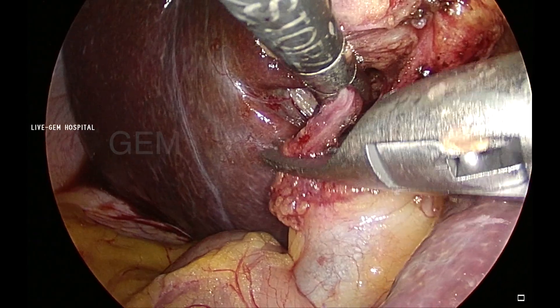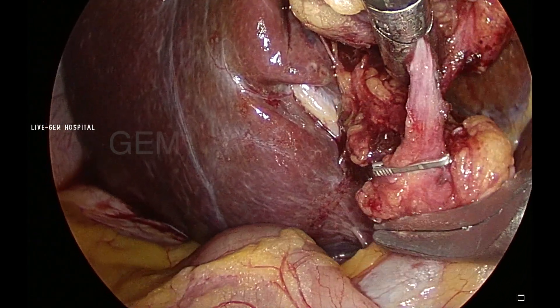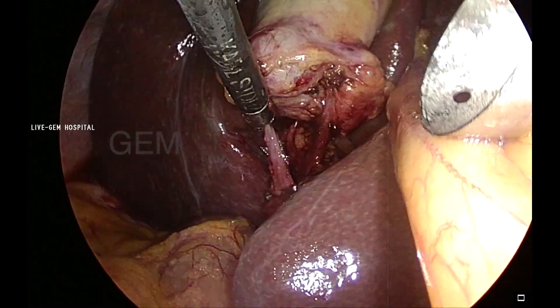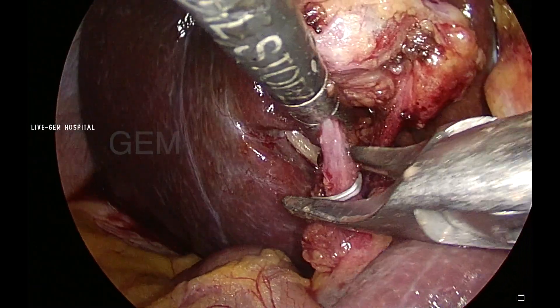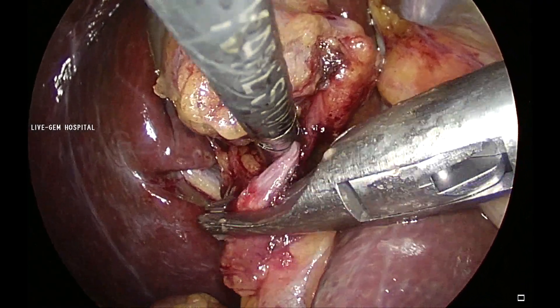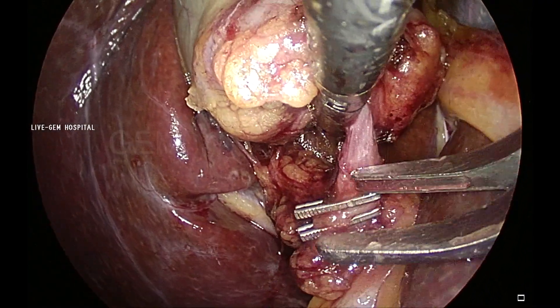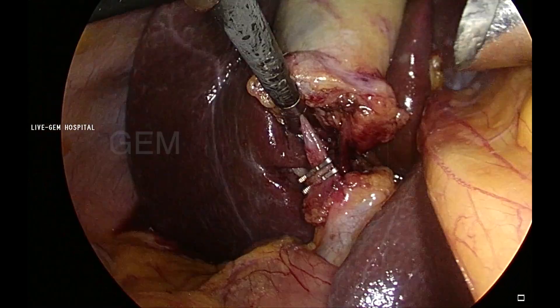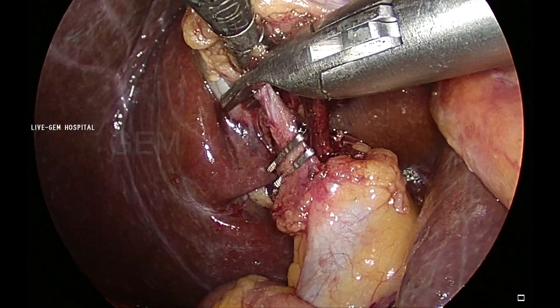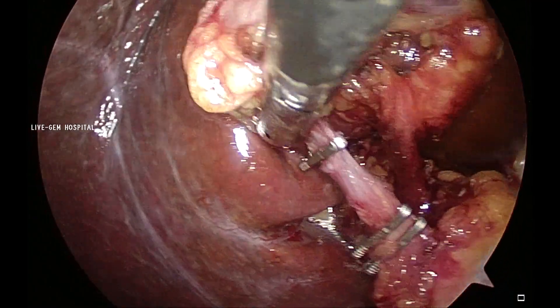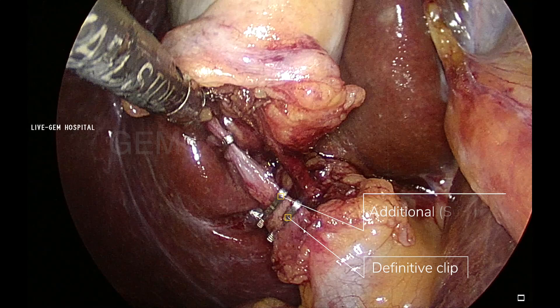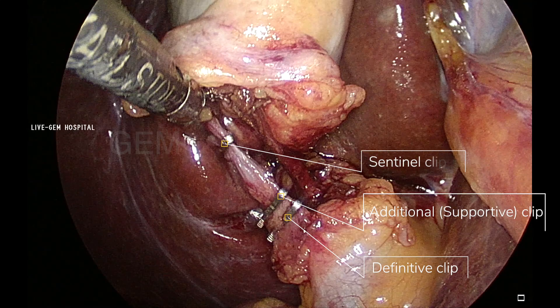See, I am applying a clip — you can see around 3-5mm gap between the clip and the junction of cystic duct and CBD. That is the definitive clip; this is a supportive clip, otherwise called an additional clip. These are all 9mm clips — we call them medium-large clips, otherwise called green clips. And this is the sentinel clip I am applying. That is: definitive, additional or supportive, and sentinel clip.